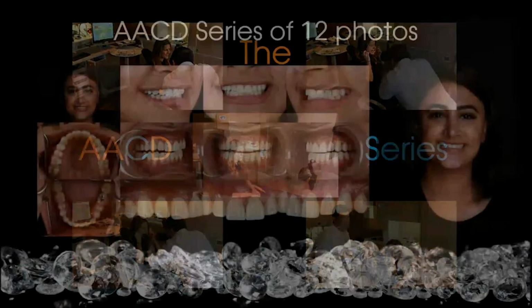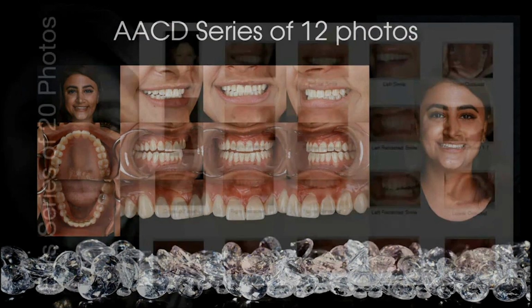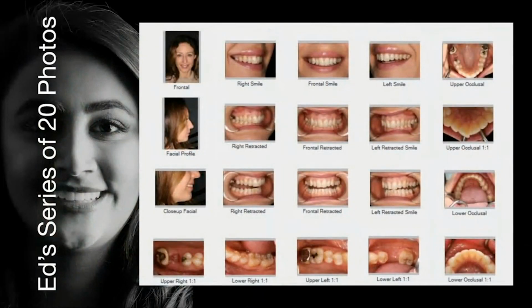So those 12 images are simply that: a headshot, a smile, a retracted smile with the teeth slightly apart, and upper or lower occlusals, and the anterior teeth up front. Now, for me, I want more information than that. So this is my series of 20 I like to take for every new patient that comes in. You may have your own different tastes and take your own different ones, but I find this is generally the one I start with, and I can add more to it if I like.